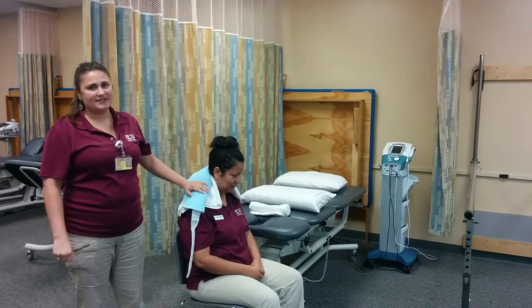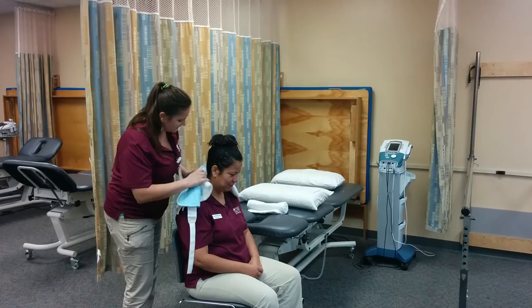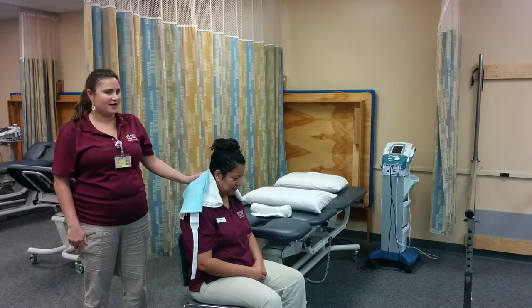After 10 minutes has passed, I'm going to re-assess her skin. Anna, how are you feeling? Still doing good? Let me take a look. Okay, I will leave her there for another 10 minutes, so a total of 20 minutes underneath the hot pack.